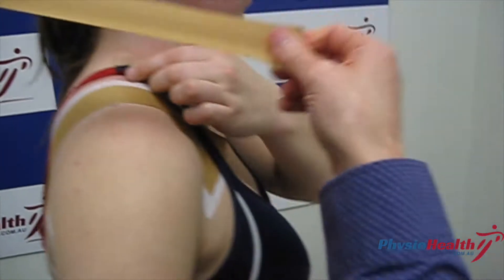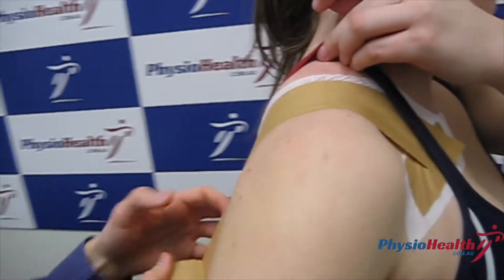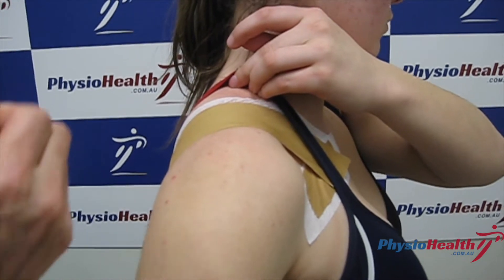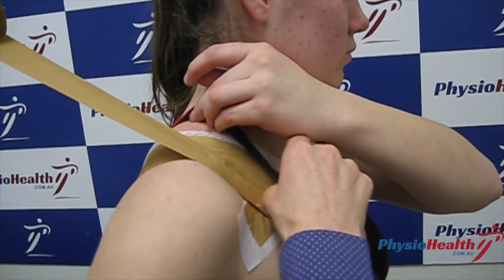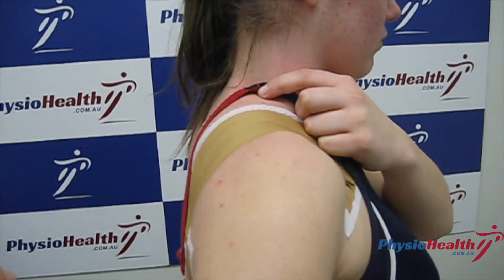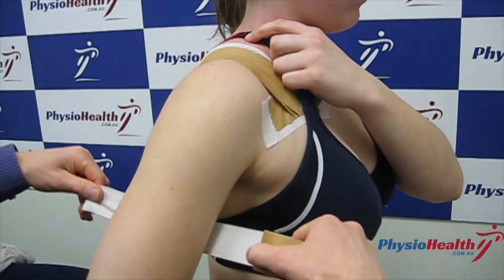Do two or three strips from front to back. Try not to get creases in your tape. Then apply another anchor around the bicep area, just below the level of the deltoid.